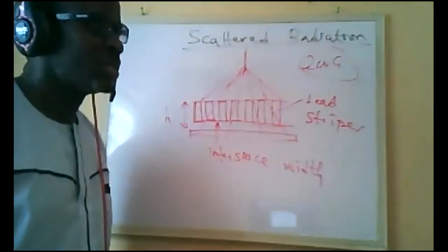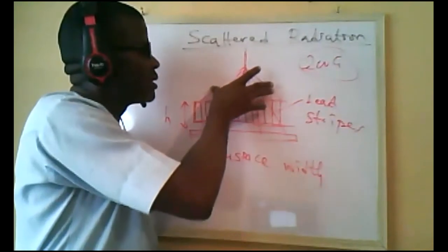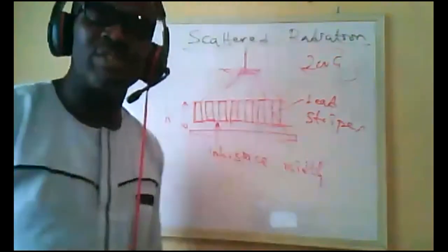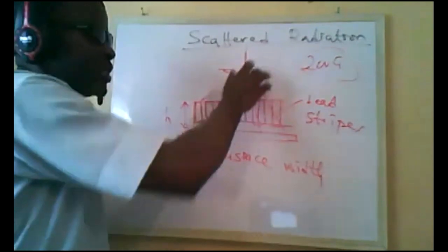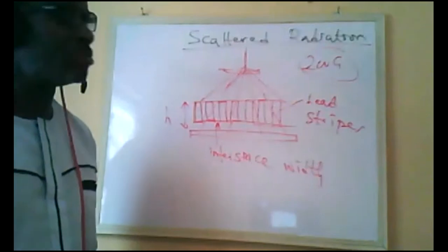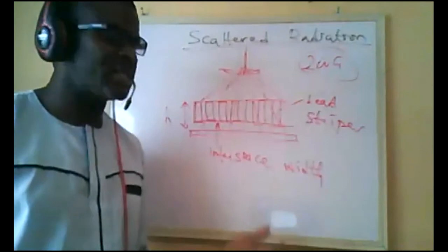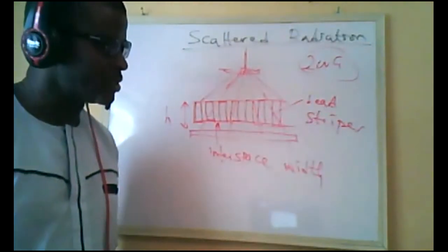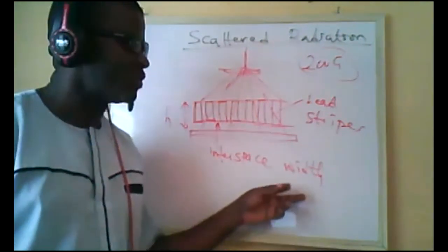So it means the patient receives that much more. With that, we now have much more exposure on this patient. So the presence of a grid actually increases the radiation dose to the patient. And we can't do anything about that. It just has to be there. At least we are looking at a very, very good image.